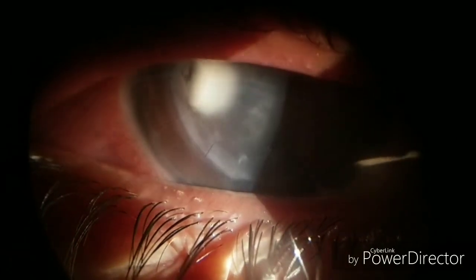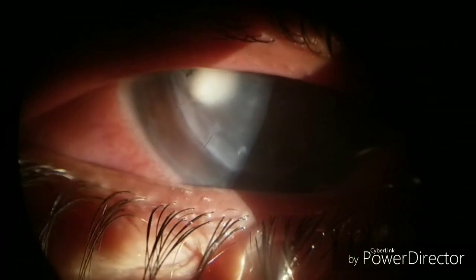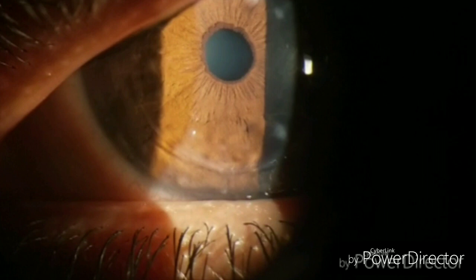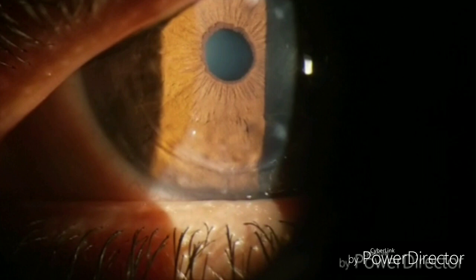If a few stitches are removed, it means the procedure was done a few months back, and if no suture is present, it means at least a year back. Stitches also give you a clue about full versus partial thickness. To check for full thickness, examine the graft-host junction depth — if a line is present all along the full corneal depth, it means it is full thickness.